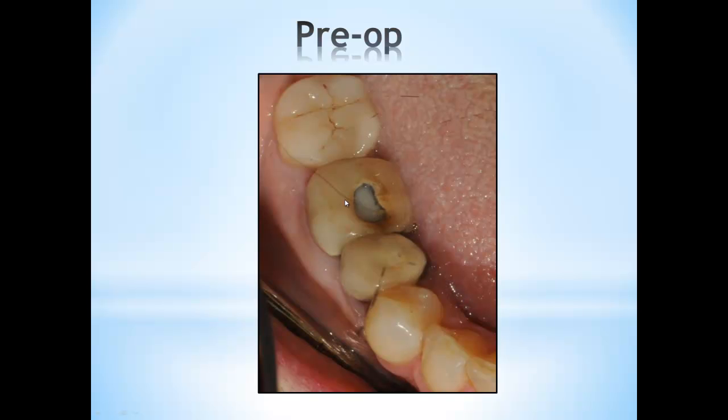You can see the crown was probably done previously, and the patient developed some kind of symptoms, and the root canal was done. And once again, the root canal failed because an instrument broke, and an apicectomy was done. You can see my number 31 Emax crown, but again, we have to change it due to poor fit. And I want to make sure the crowns are going to last much longer.